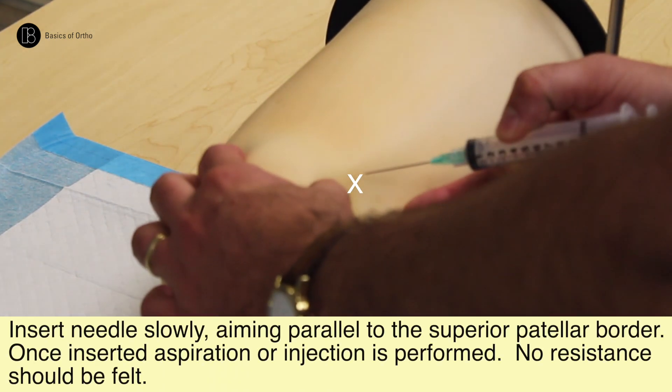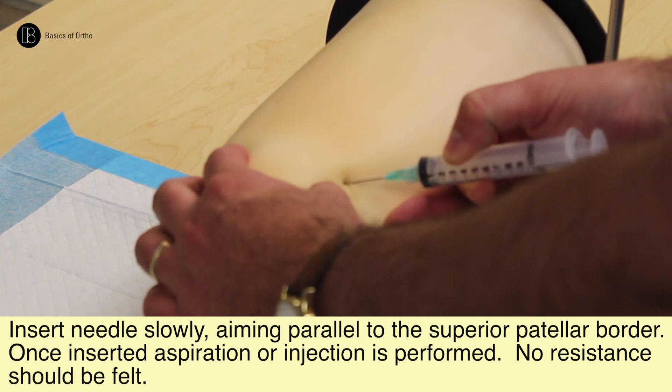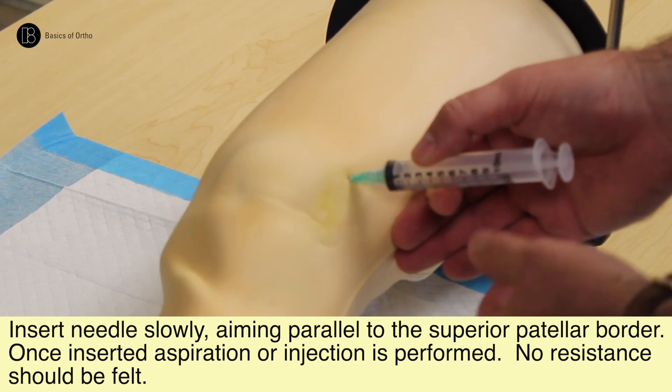After sterile prep, the needle is inserted slowly in a direction parallel to the superior border of the patella.